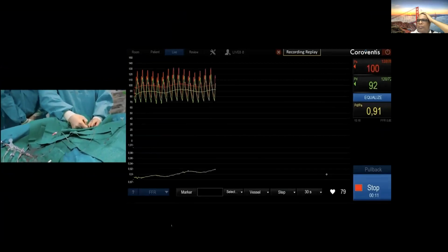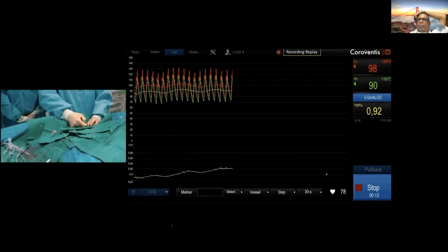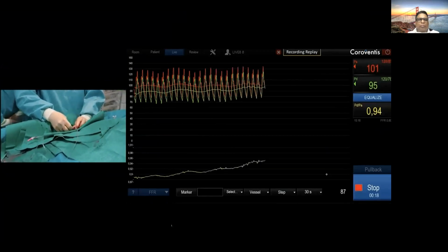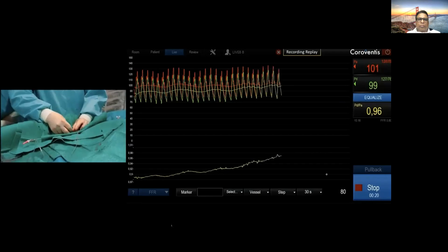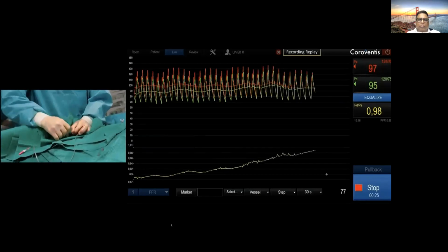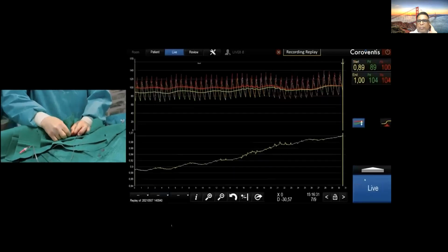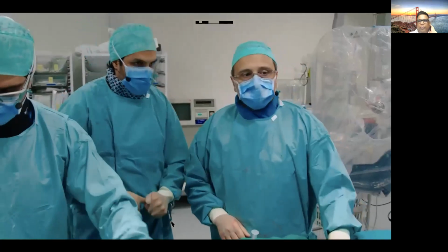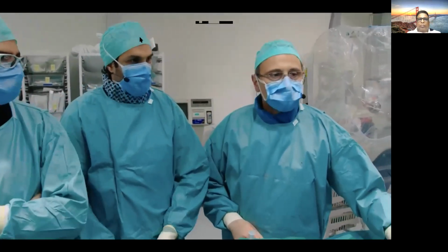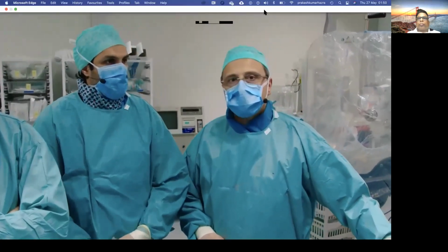You see here that there was a small step in the distal part of the vessel. Now we are inside the stent. This was the region with the calcified plaque. Okay, Carlos, I think we are done here. We'll have time to discuss the case with you in the studio. So back to you, Jolt. We'll see you there.